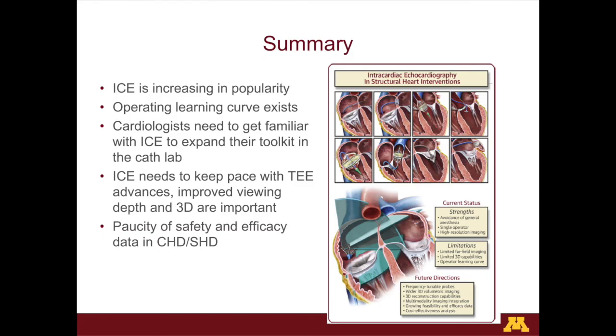So in summary, ICE is increasing in popularity. There is an operator's learning curve that exists, but we as cardiologists need to get familiar with ICE so that we can expand our toolkit in the cath lab.